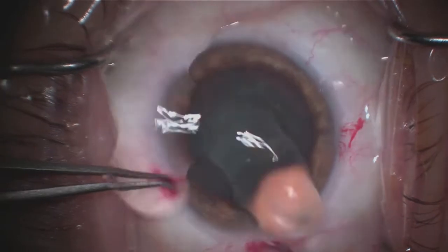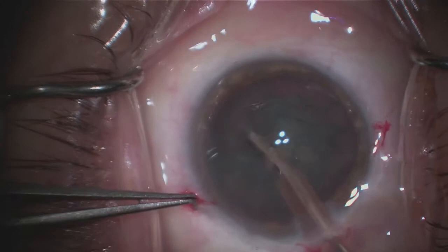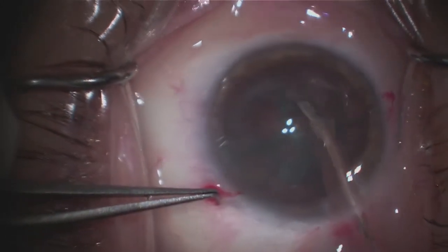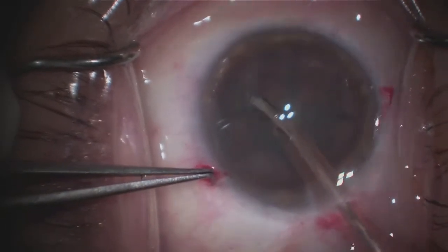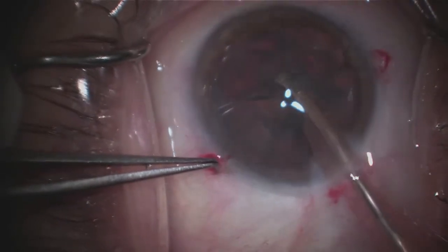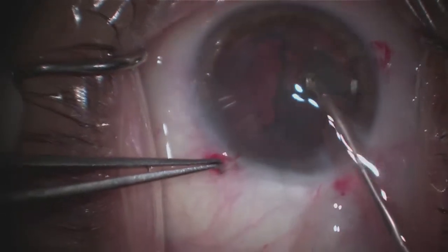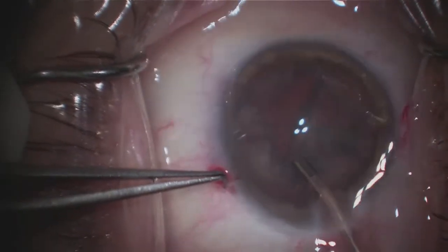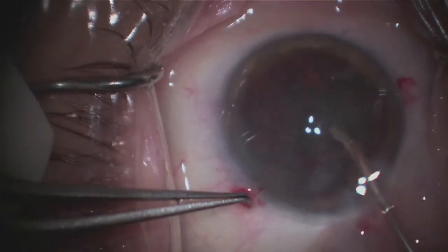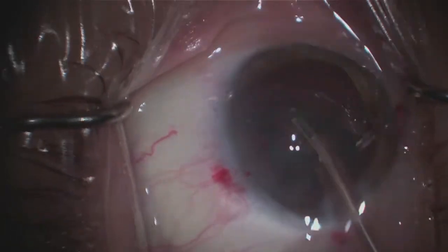Next, I'll go in with an ultrasound device called phacoemulsification, connected to a foot pedal. Fluid is going into the eye to keep it maintained, and as I depress the foot pedal, it increases the vacuum and ultrasound, which breaks up the cataract. The vacuum then essentially slurps up the cataract. Two of those fragments have been removed.